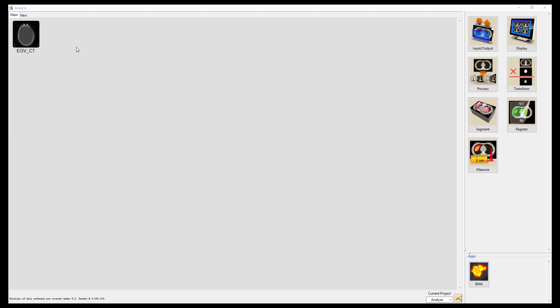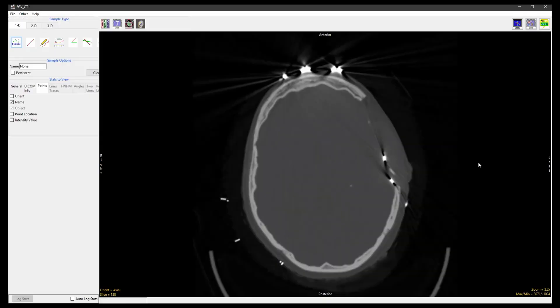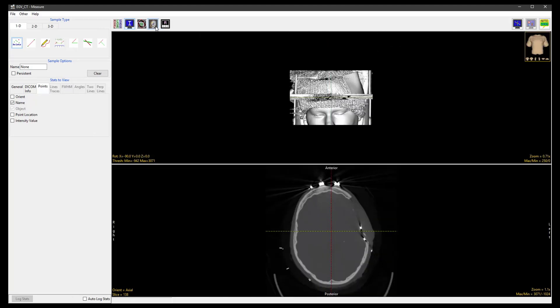To start, select the dataset and open Measure. Using the display controls, switch on the rendering window and toggle the single image so that just the rendering is displayed.